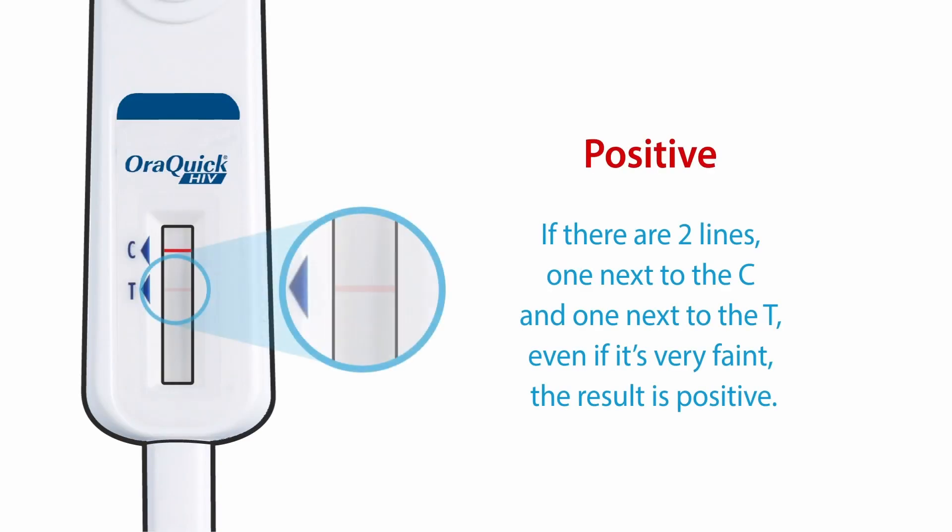Here's how to interpret the results. Looking at the collection device, if there are two lines — one next to the C and one next to the T — even if the lines are faint, the result is positive.